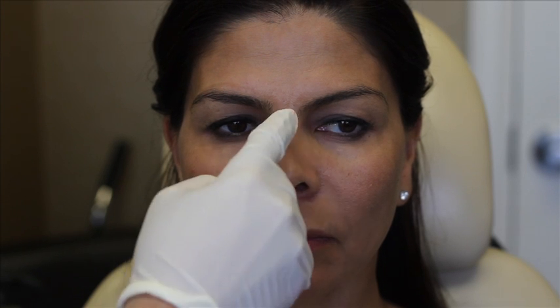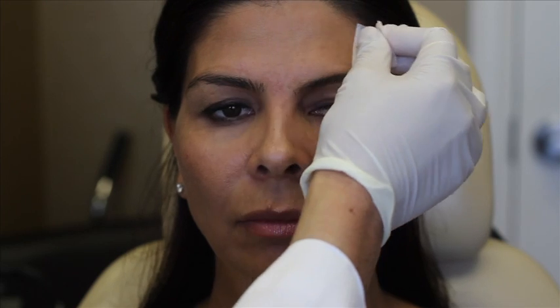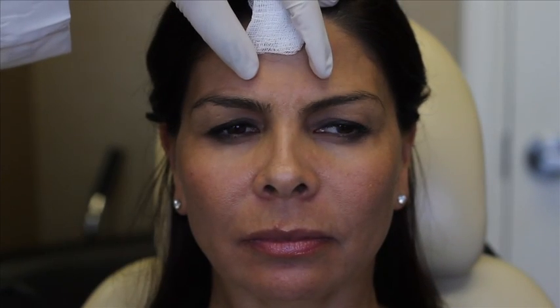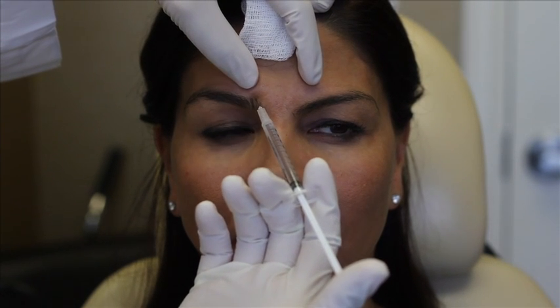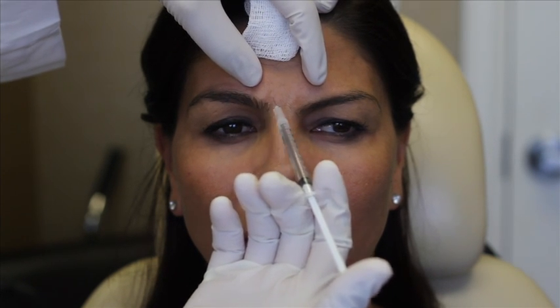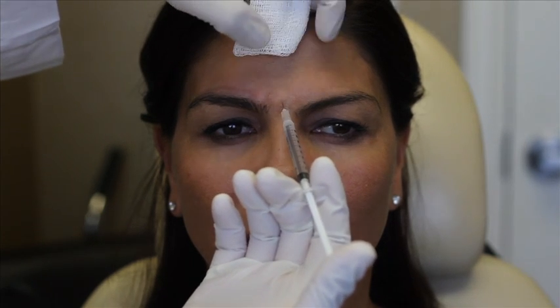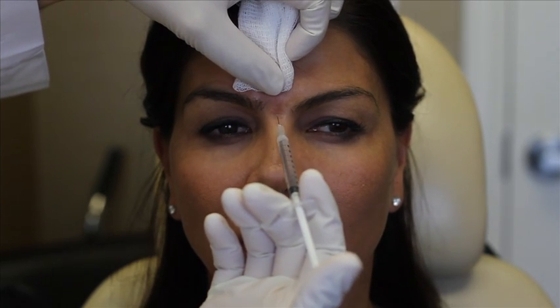So today we're going to be injecting Botox on the glabella area, which is this area, and the frontalis muscle, so the forehead can be smooth, and the crow's feet region, which is also a common area. Frown for me, please, and relax. Good. So you see the action of this one. We're going to go in, and typically I only inject about 15 units in the glabella. So we're injecting on the dynamic side.